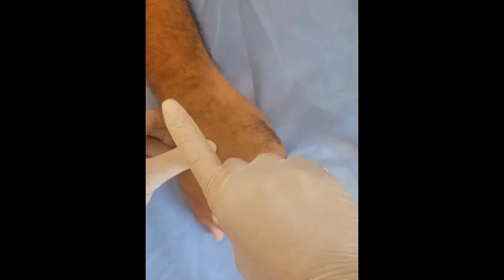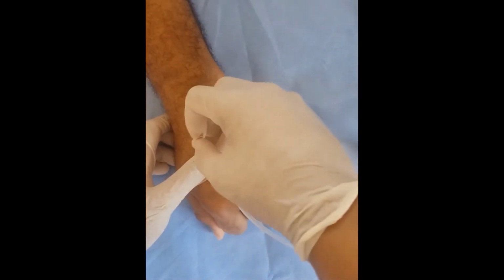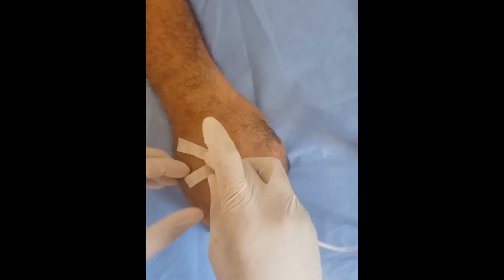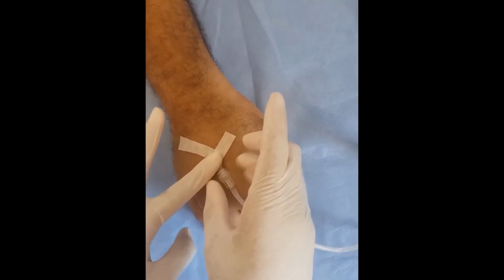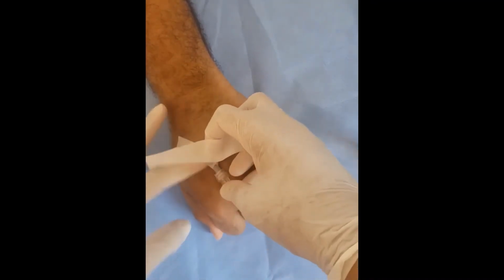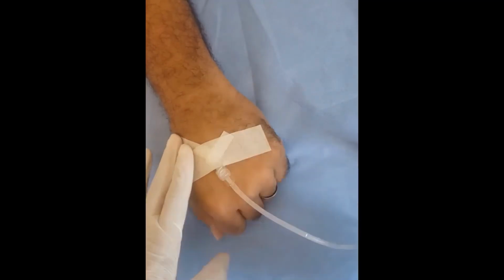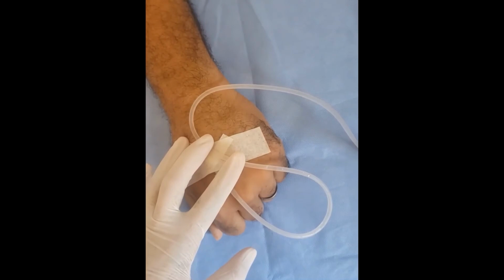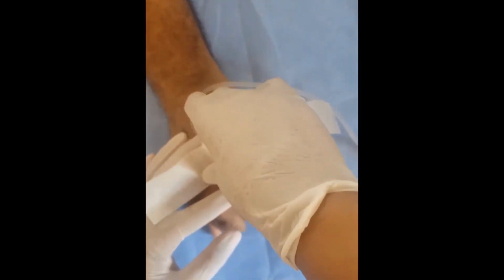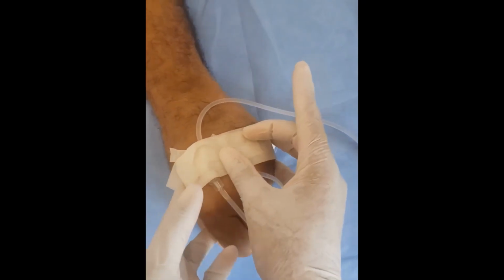To secure the intracath, you will need 3 main pieces of tape. A thin one to anchor, and then a wider one, which is usually the other half that the thin strip was cut from, that secures the anchor. Both of these should not obstruct the function of the luer lock. The final piece is meant to secure the IV tubing, so that if there is any tension that occurs, the anchor bears the brunt of the force and the IV is not displaced.